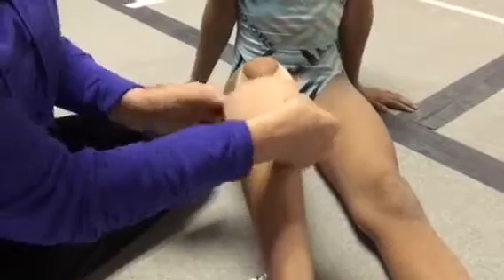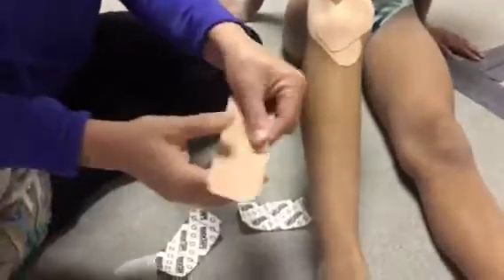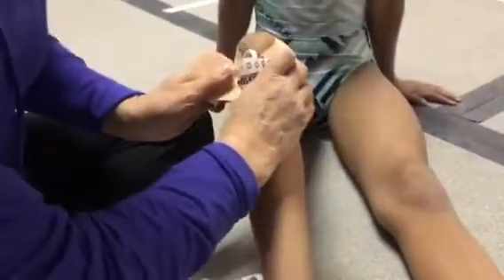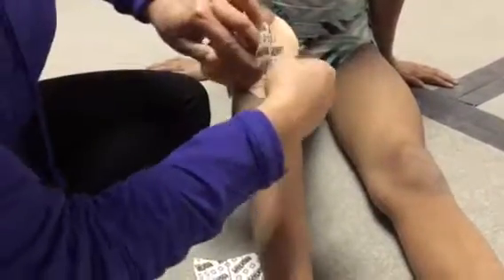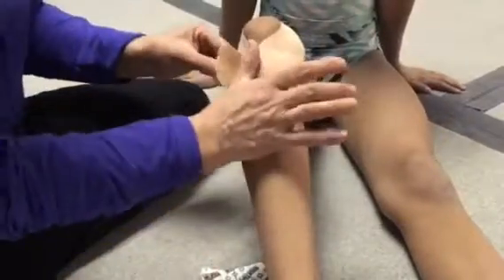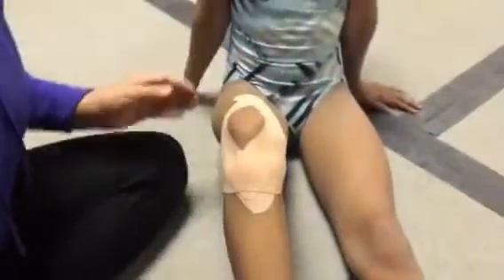Then you have a third piece that goes over the bump and just along the joint line like that. For this one, you split it in half and stretch it 50%, put it right over that bump, and then it goes right along the joint line like this.